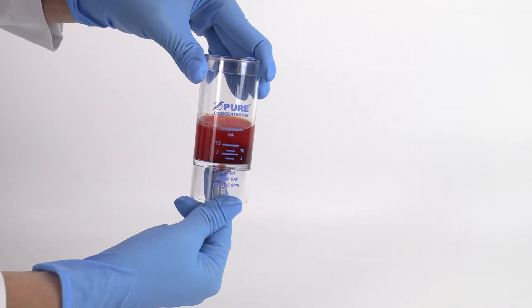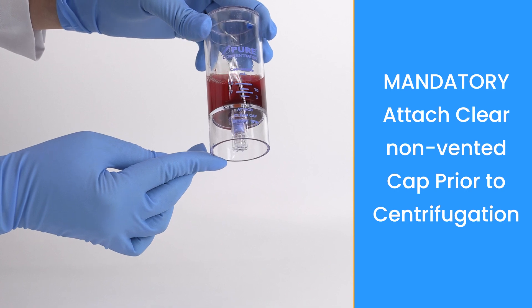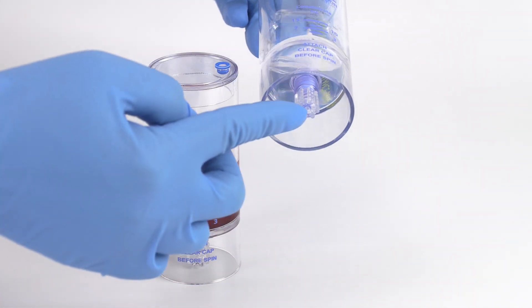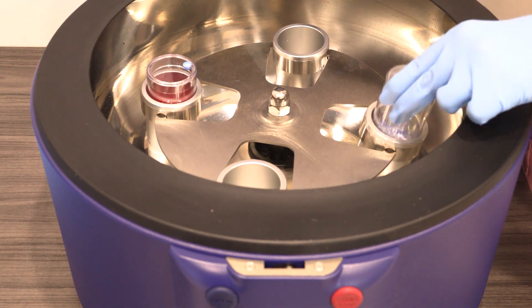As a mandatory step, always attach the clear non-vented cap to the bottom port prior to centrifugation. Use the counterbalance device to counterbalance with equal volume. Be sure to always place the clear non-vented cap to the bottom port of the counterbalance device as well, and place back into the centrifuge rotor at opposite ends.